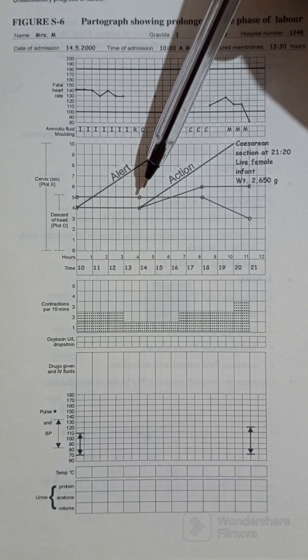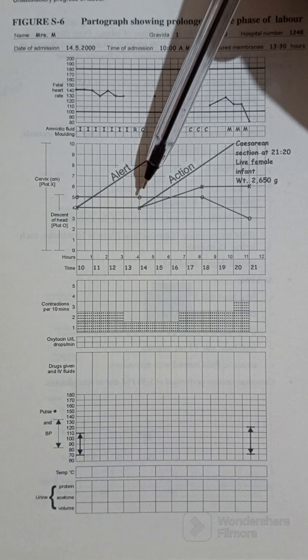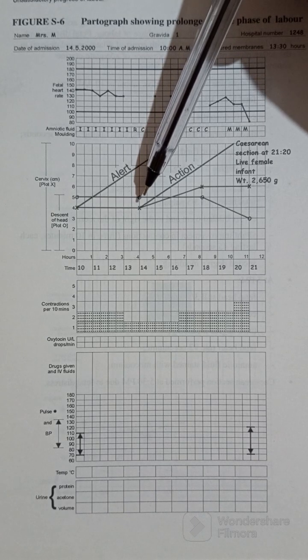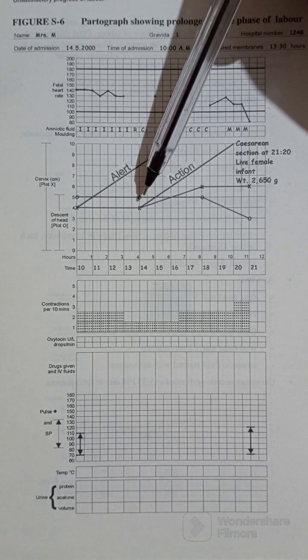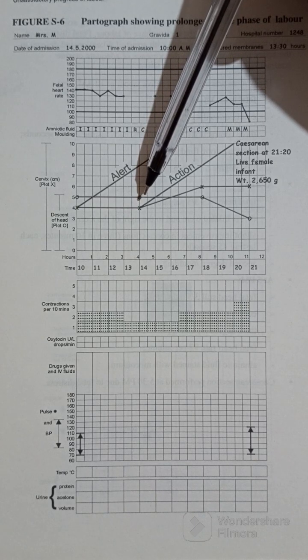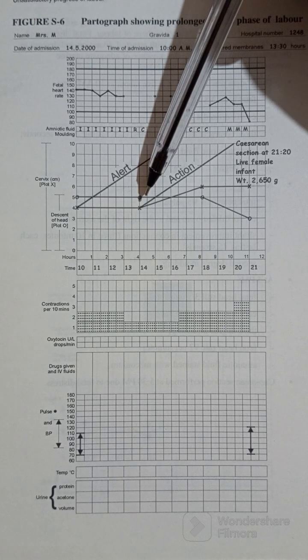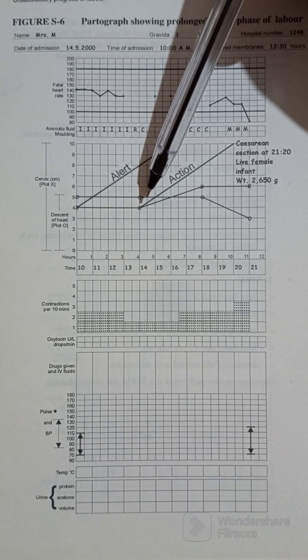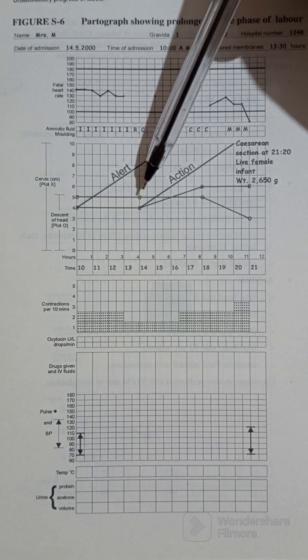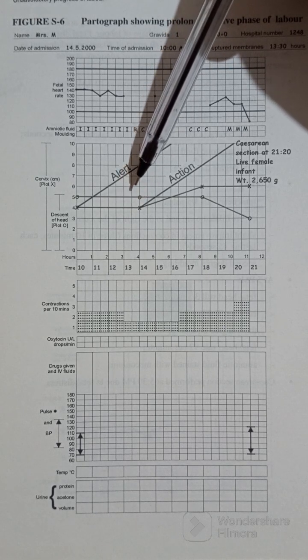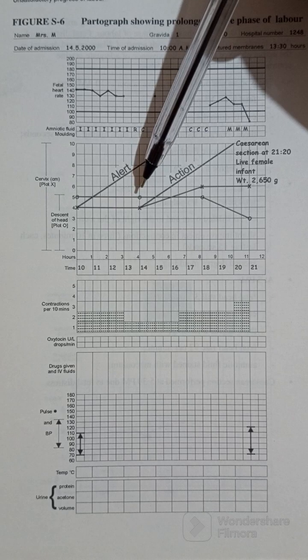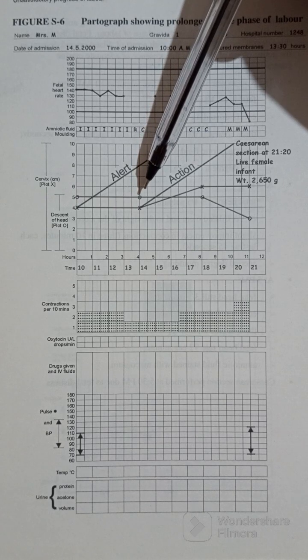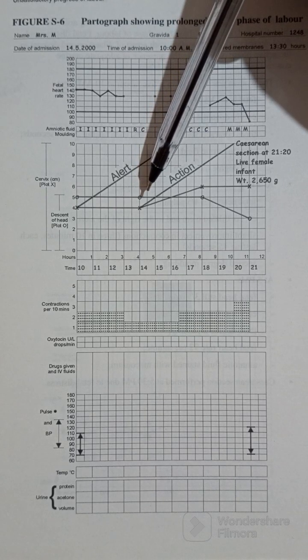And the cervical dilation was at four centimeters. There was no change, it was constant. Fetal descent was still at five over five as well.